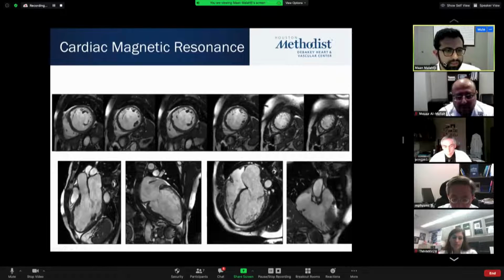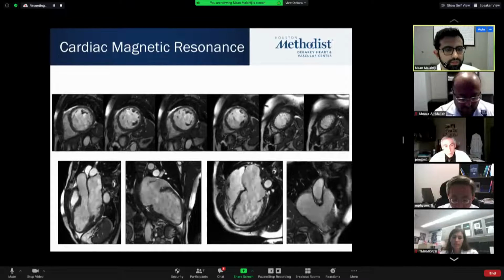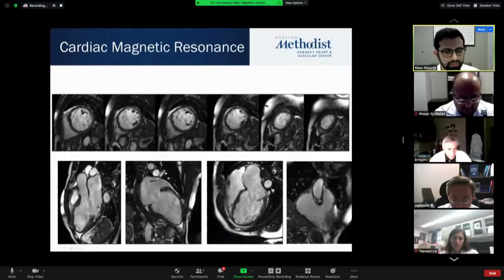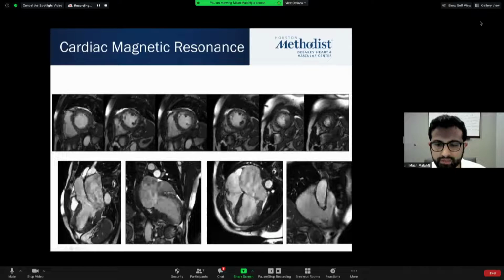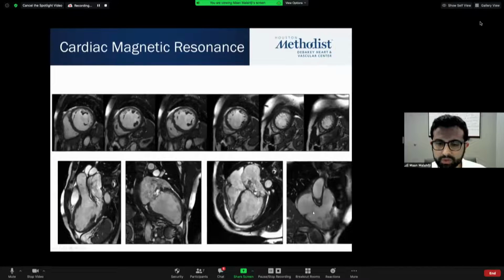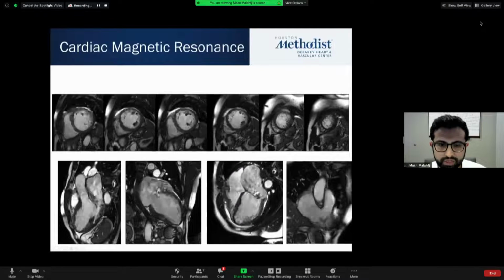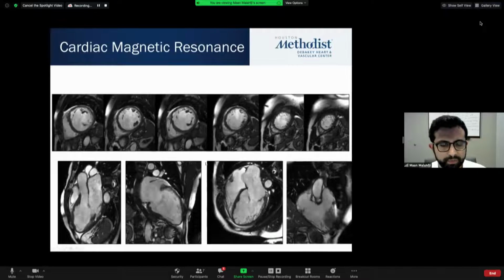So we begin with the standard views covering the short axis of the ventricle. As you can note, the left ventricle is severely enlarged. There is significant prolapse of the posterior leaflet with high suspicion for a flail segment. If you notice this view that we obtained to look at the tricuspid valve and the pulmonic valve, as well as right ventricular free wall motion, you notice slight prolapse of the tricuspid valve as well, with no evidence of significant TR on this view, albeit the visualization of the jet is not always definitive on these views, and can be highly impacted by scanning parameters.